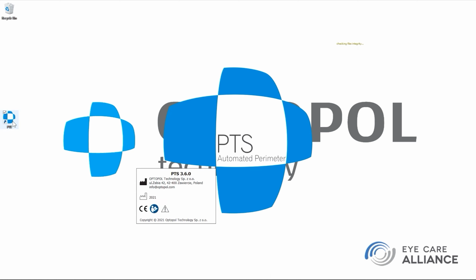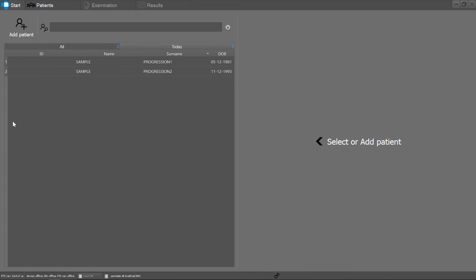Double-click the PTS icon on the desktop, or single-click the PTS icon on the taskbar to open. The software will present the Start menu upon opening. Use the active search bar to find existing patients. Typing the first few letters of the first or last name will automatically generate search results. The Today tab will display only patients tested on the current day, for quick reference. To search the entire patient list, ensure the All tab is selected.